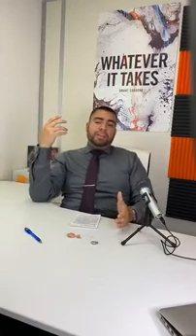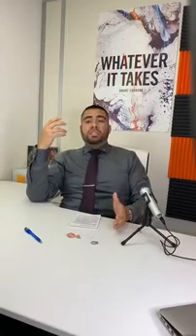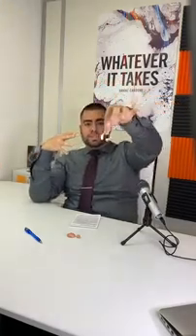So again, we're going to be talking about behind the ear styles and custom in the ear styles. I'm going to be showing you guys some demos. This is a receiver in the canal, one of the behind the ear styles. This one specifically is from the brand Starkey, and we've got the small CIC and the bigger ITE custom styles that go inside the ear.